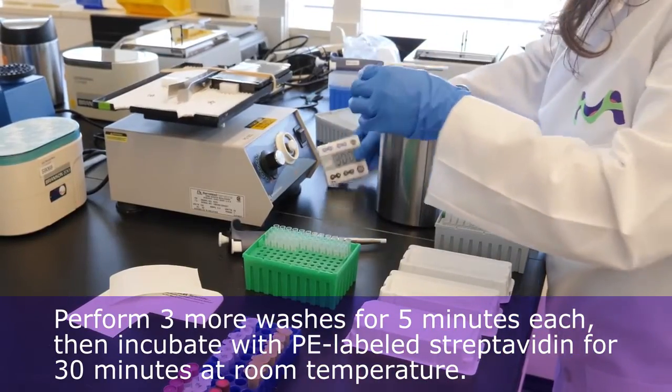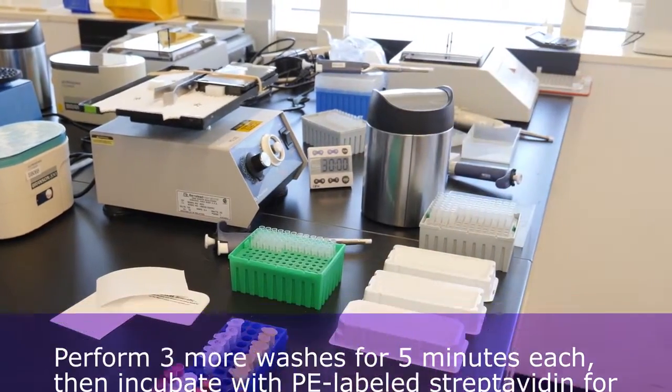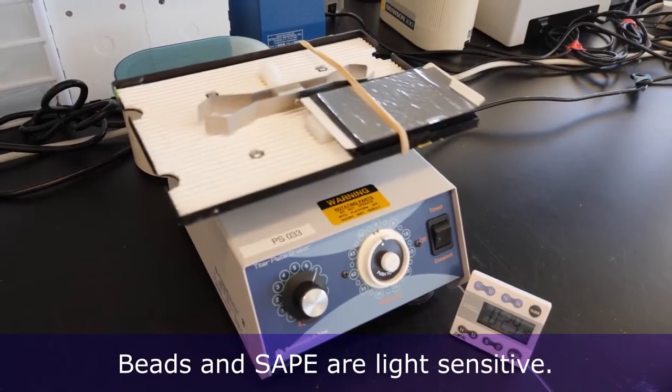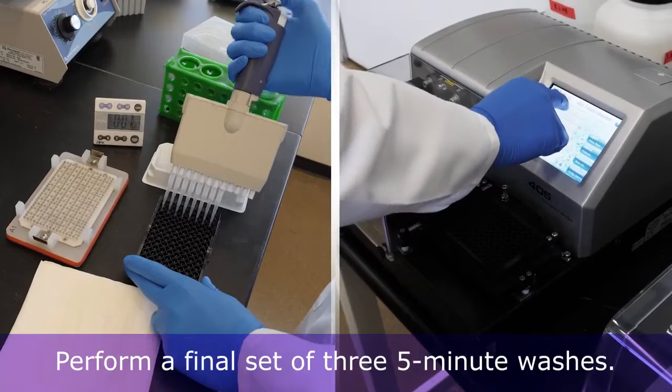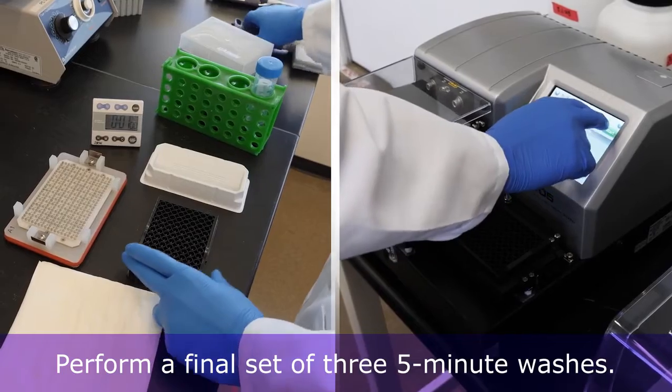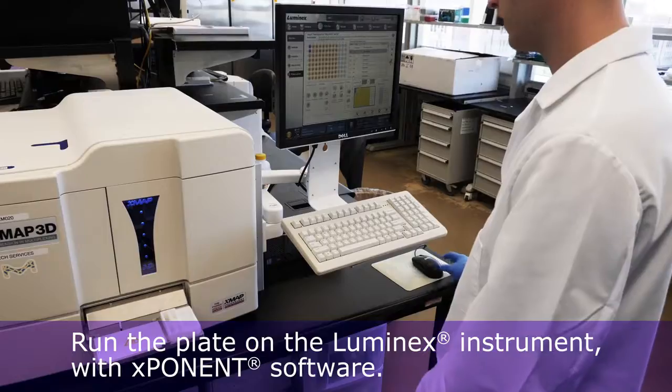Next, perform three more washes for five minutes each, then incubate with PE-labeled streptavidin for 30 minutes at room temperature. Remember that beads and SAPE are light sensitive. Finally, perform a final set of three five-minute washes.